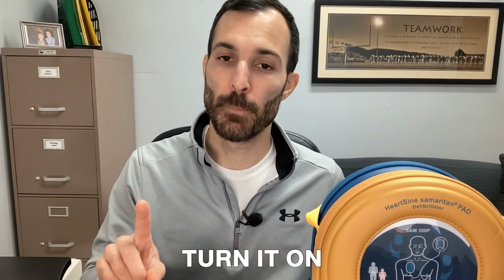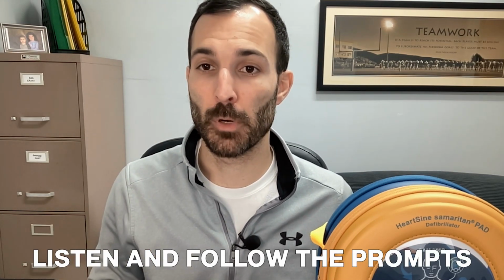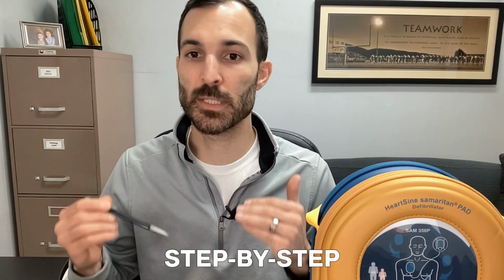Two steps to use an AED machine. Number one, turn it on. Once you turn a machine on, it will give you audible prompts and walk you through step by step what to do. Step two to using an AED machine: listen and follow the prompts. Again, really user friendly. They will walk you through step by step exactly what to do, right?